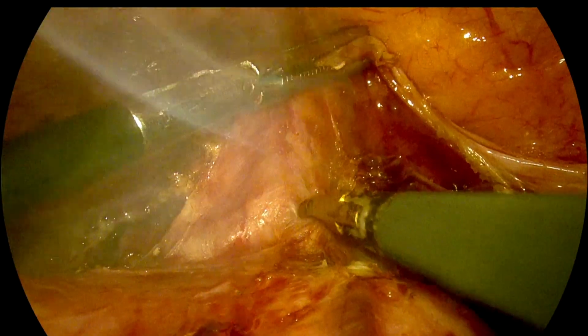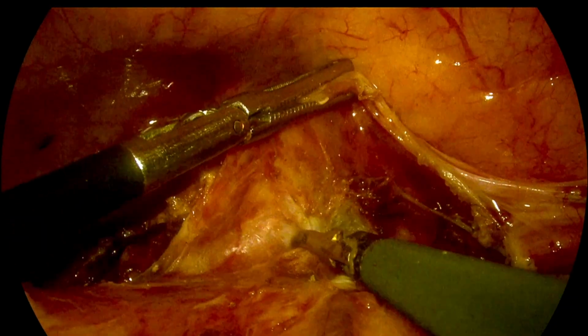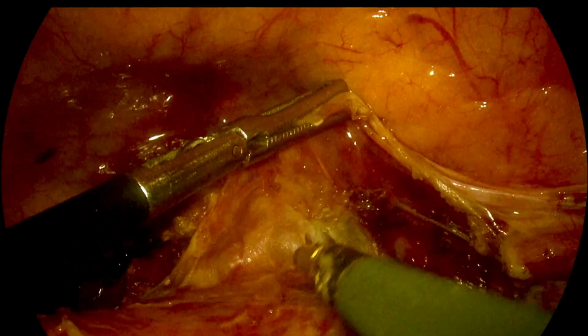We can see a significant amount of bladder dissection is done. Still, we are not reaching the cervix area.